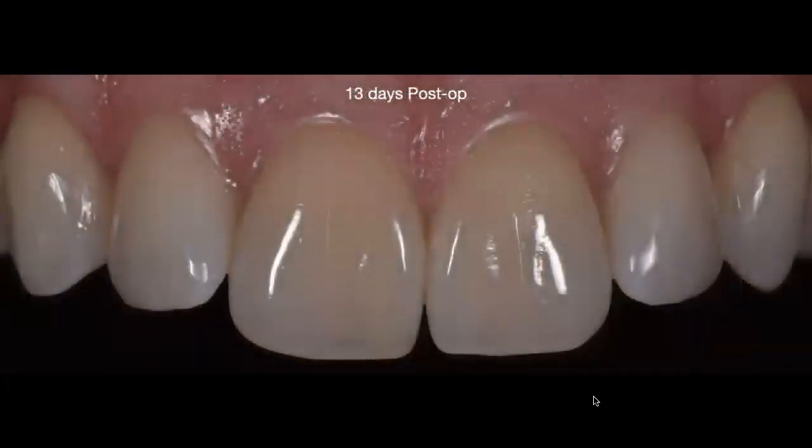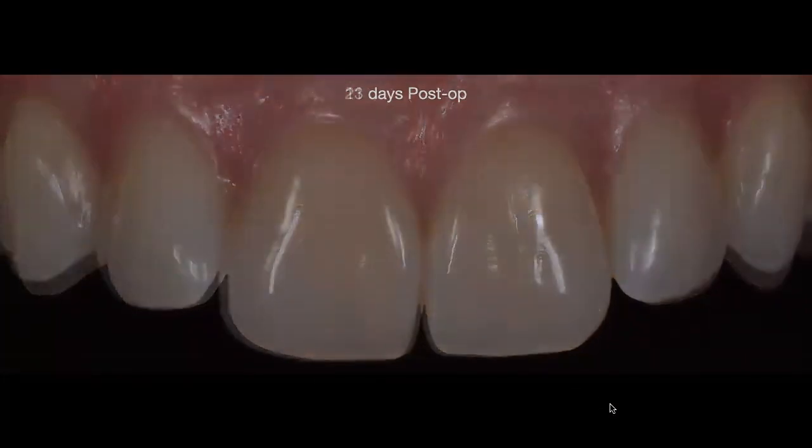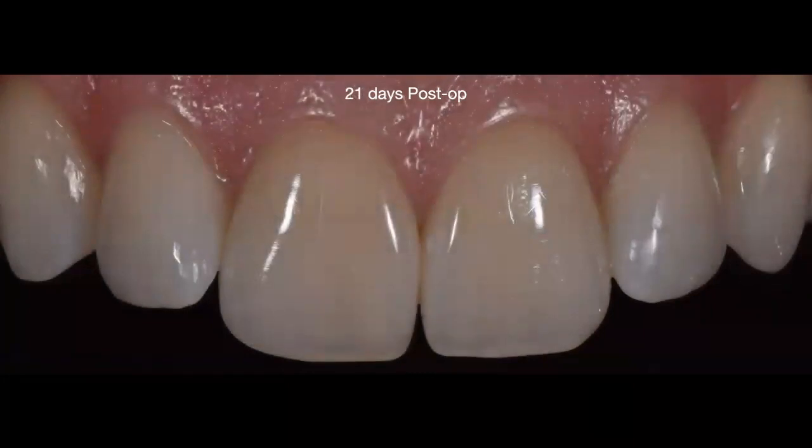So now this is 13 days. And what do you see on the 13th day? You see that now these teeth are becoming lighter. But you can see that 9 is a little bit lighter in the gingival middle third than number 8. And the other thing that you can see, you don't see the gingival irritation anymore. So just by trimming the tray a little bit more in that area, problem solved for the patient. And again, we're just going to continue with 10%.